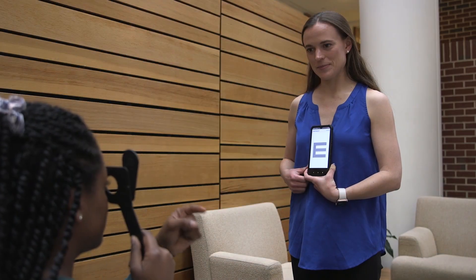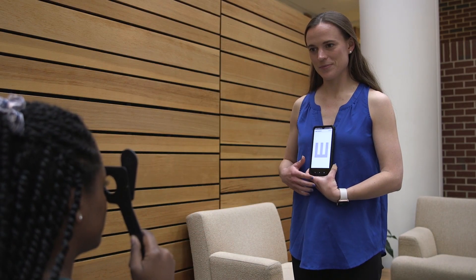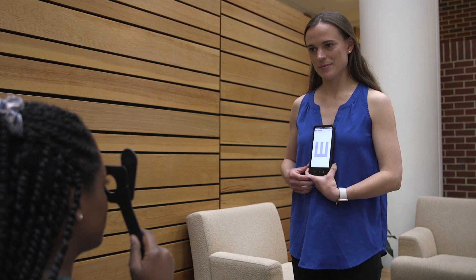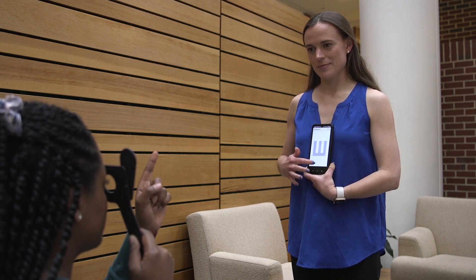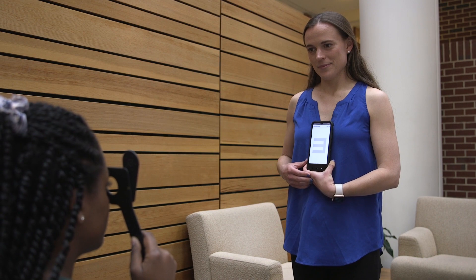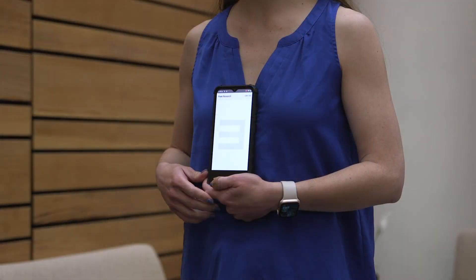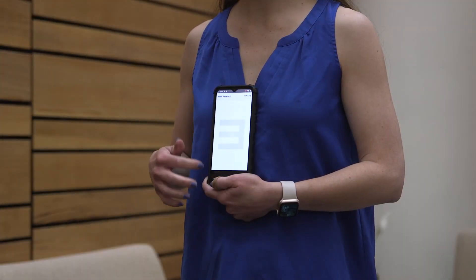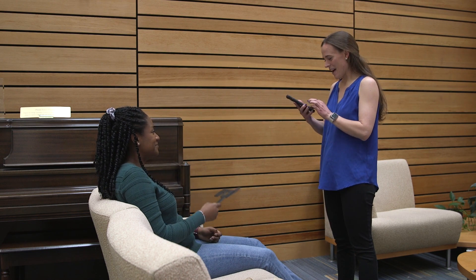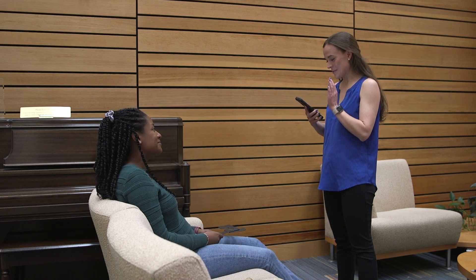You will hear a noise and feel a vibration from the phone as feedback that the response was registered. The E has now switched to another direction and changed contrast. Ask the participant again what direction the E is facing and swipe the phone screen according to their response. Continue prompting the participant and swiping the phone screen with their response until you hear the final noise and feel the vibration from the phone. This indicates that you have completed the screening for the right eye.